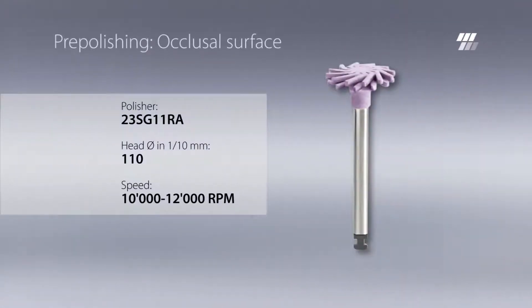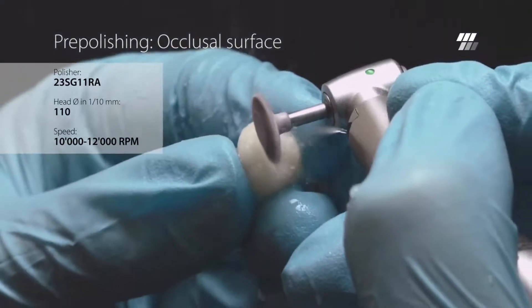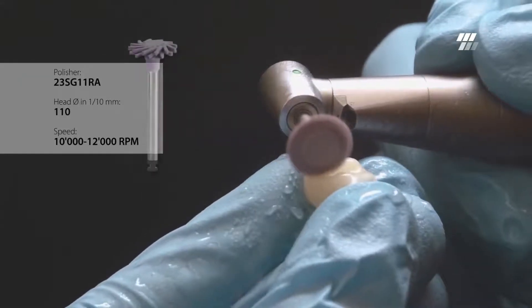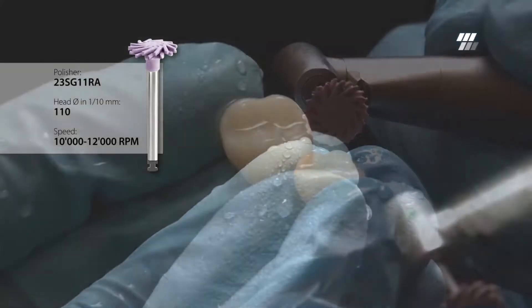As a first step, pre-polish the composite with Diatek ShapeGuard Comprapol Plus. Use the head diameter of 11 mm to pre-polish the occlusal surface, especially fissures and cusp slopes. The flexible lamellas of ShapeGuard adapt perfectly to the shape of the crown.